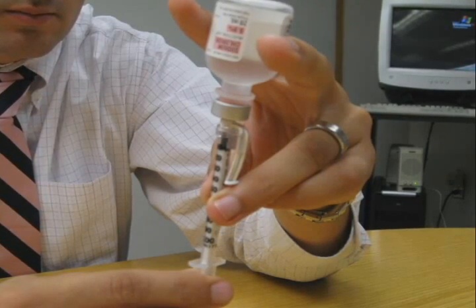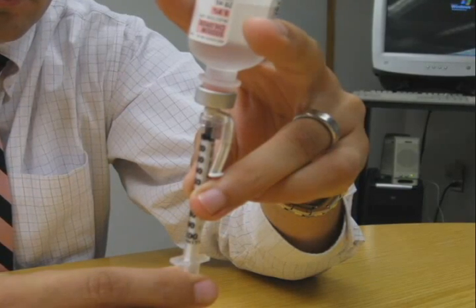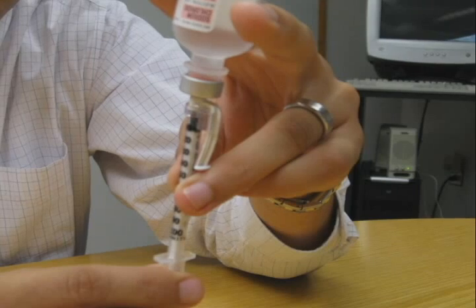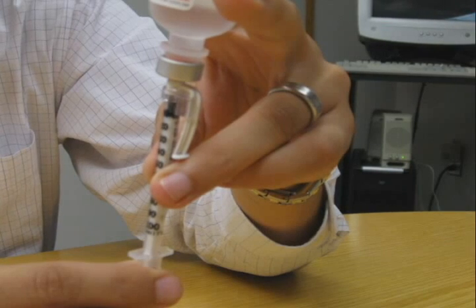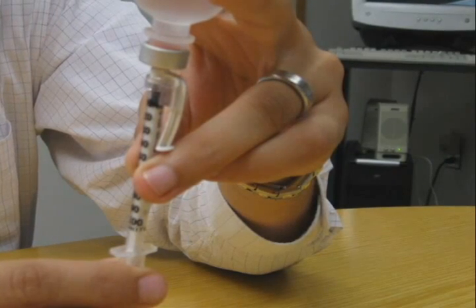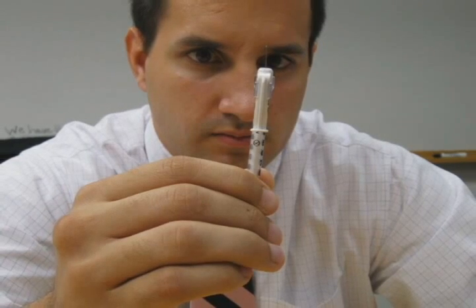With the needle tip still in the vial of insulin, turn the insulin bottle and syringe upside down, holding the vial of insulin with one hand and the syringe in the other. This takes practice, but soon you will be able to manipulate the syringe and vial with little difficulty. Pull back on the plunger to get the desired dose of insulin. The end of the plunger should be at the same mark as it was when you drew in the air. If air bubbles appear in the syringe, gently flick the syringe with your finger to make the bubbles rise to the top and push the insulin back into the vial. Draw back on the plunger a second time to get the desired dose. Very tiny bubbles are not a concern. Pull the syringe out of the insulin vial and double check the dose withdrawn, making sure there are no large air bubbles and that the tip of the plunger is at the desired line for the correct dose.